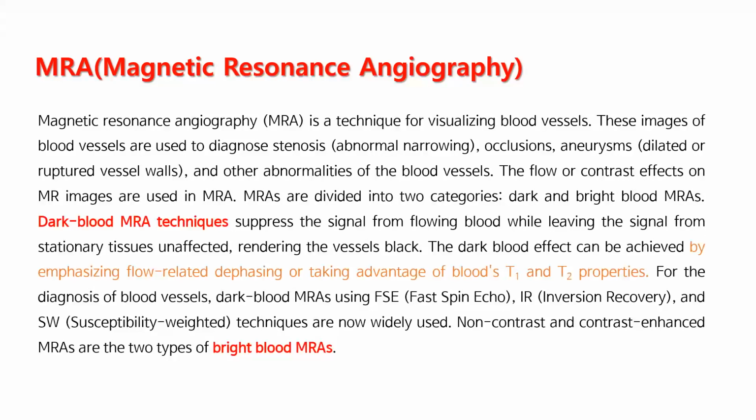Magnetic resonance angiography, MRA, is a technique for visualizing blood vessels. These images of blood vessels are used to diagnose abnormal narrowing, occlusions, dilated or ruptured vessel walls, and other abnormalities of the blood vessels. The flow or contrast effects on MR images are used in MRA.